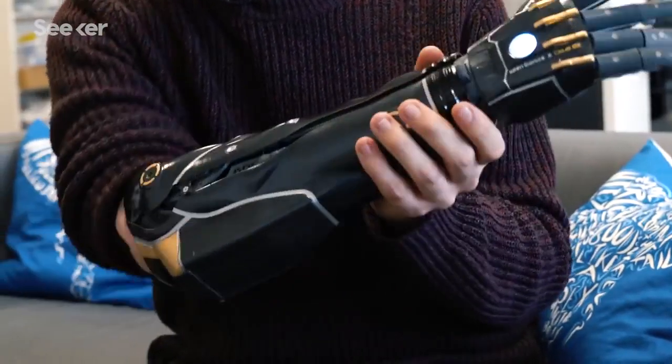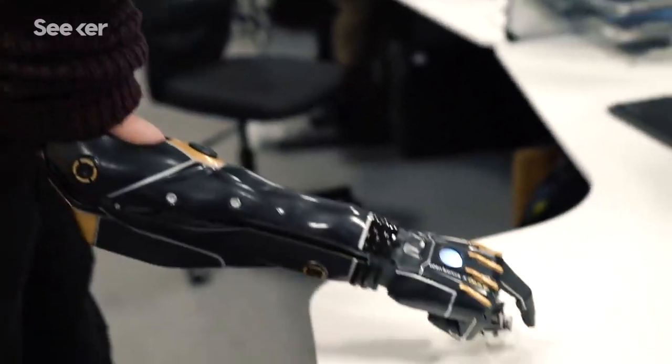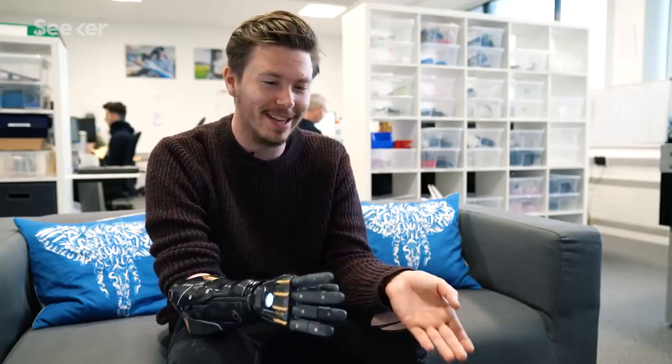It's just gotten better — at first I was like, 'Oh yeah, it just needs to open and close,' but actually being able to pick up more dexterous items, or even picking up something heavy, holding a tray and opening a door — opening a bottle of water is a major thing.